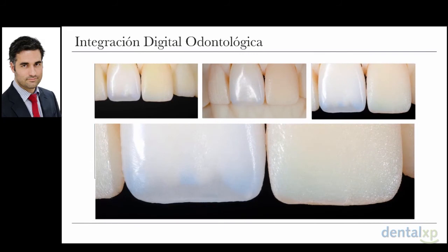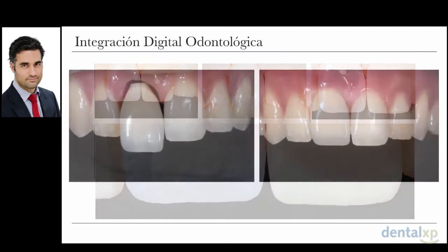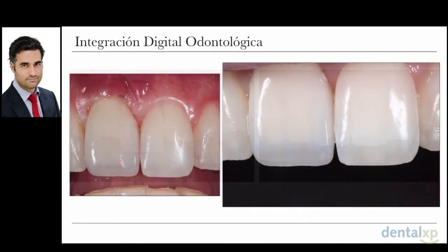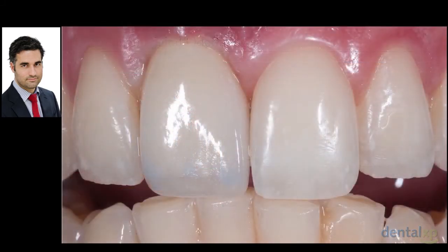Then I did the test of the abutment at my office, and then the ceramic loading. After that, we placed our definitive prosthesis, and you can see the result for the patient was good, and for me it was acceptable. You can see there is a slight pressure in the first moment, and a good final result with an almost fully digital pathway.